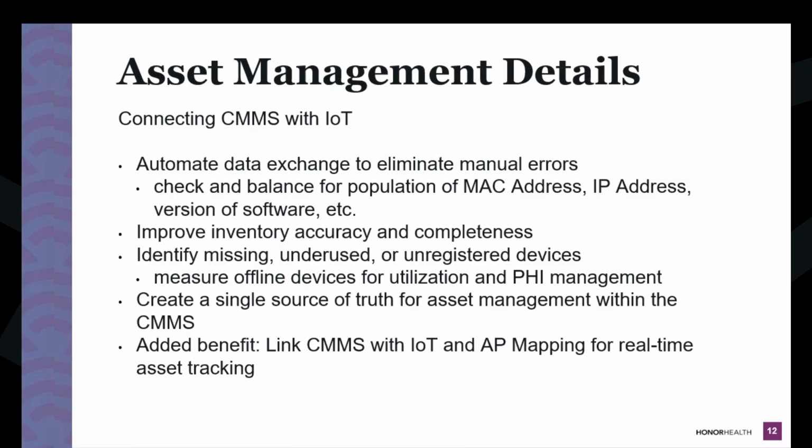Just the added benefit too, and lots of the shops have used this, is AP mapping. Where's the last place we saw that device? Okay, that's a starting point to say, let me go look there, because it's going to be somewhere in another department 2 days from now. So we were successful in doing that when you don't have an RTLS or an actual location tracking system for assets.